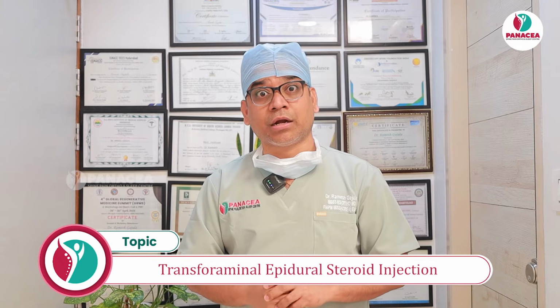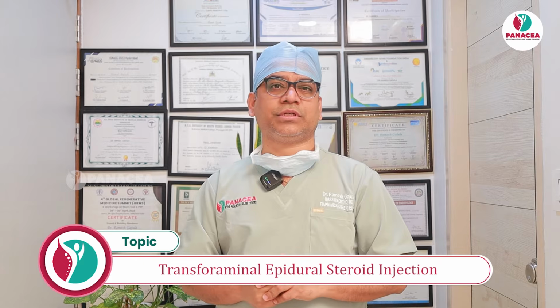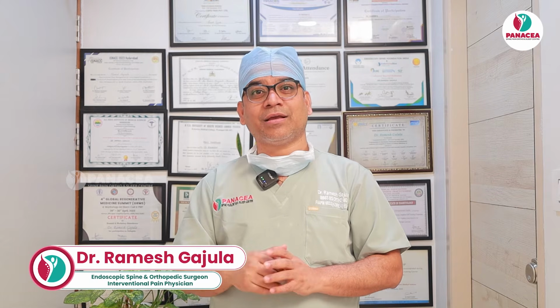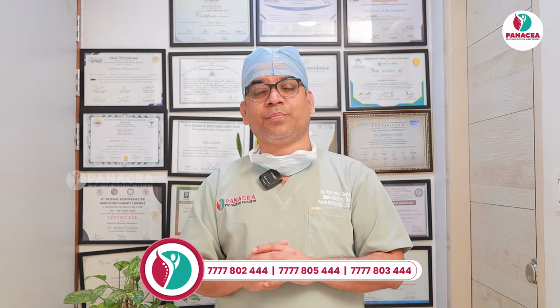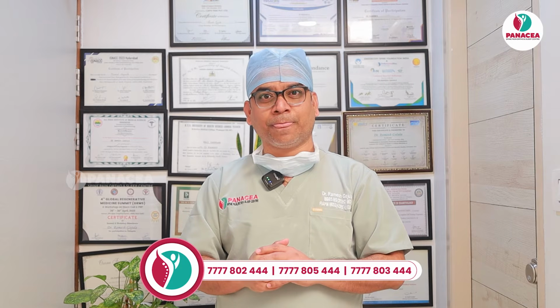Contraindications. What are the contraindications? Number one, the patient is not giving written consent for the procedure. If the patient has a local infection at the site of the procedure, any systemic allergy to the dye or the medications used for epidural, or any bleeding disorders, because it can land in an epidural hematoma. And there are some other relative contraindications also. So let us go into the procedure proper.